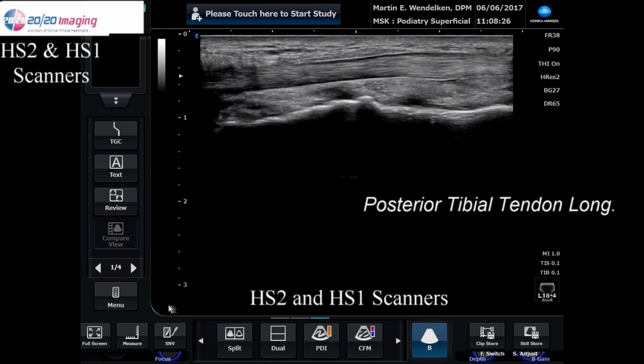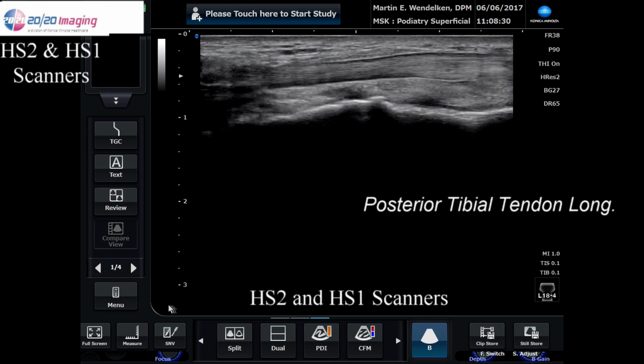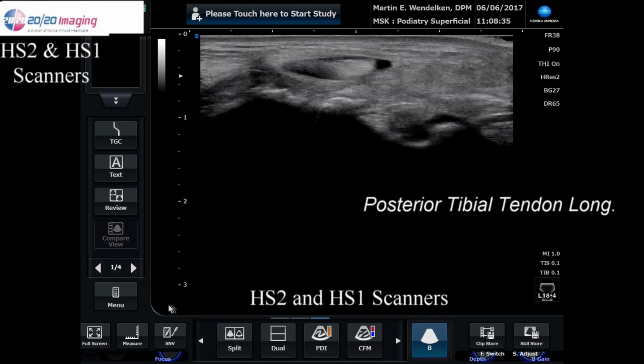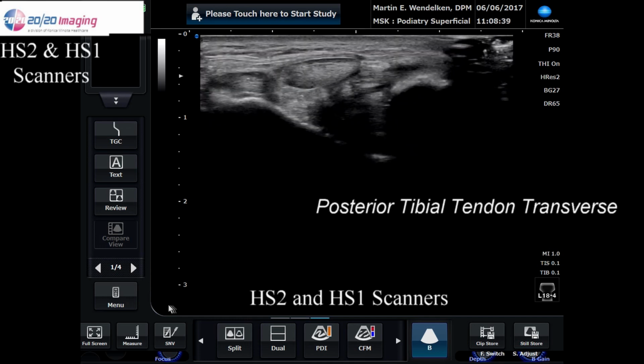We are now looking at the posterior tibial tendon there in the longitudinal axis. Again, the clarity of this machine is just unbelievable. Here we're imaging at 18 megahertz. You can clearly see the borders of the tendon. You see a little fluid on the side of that tendon there.